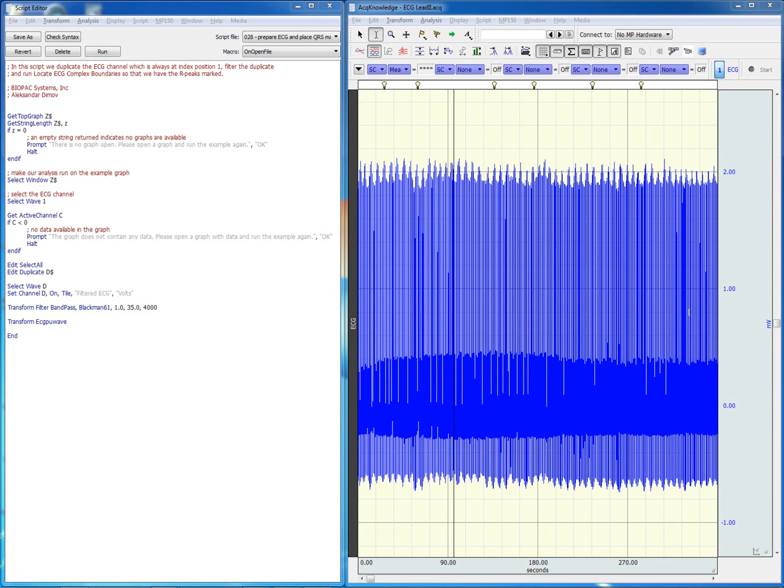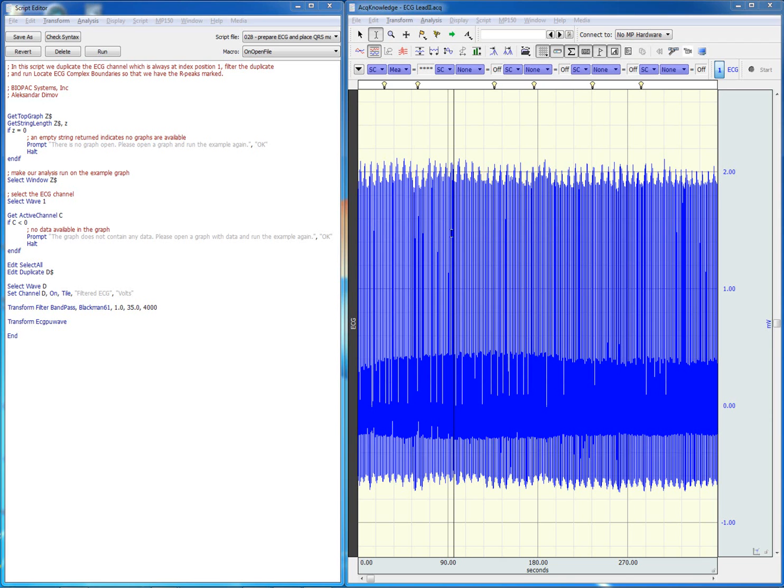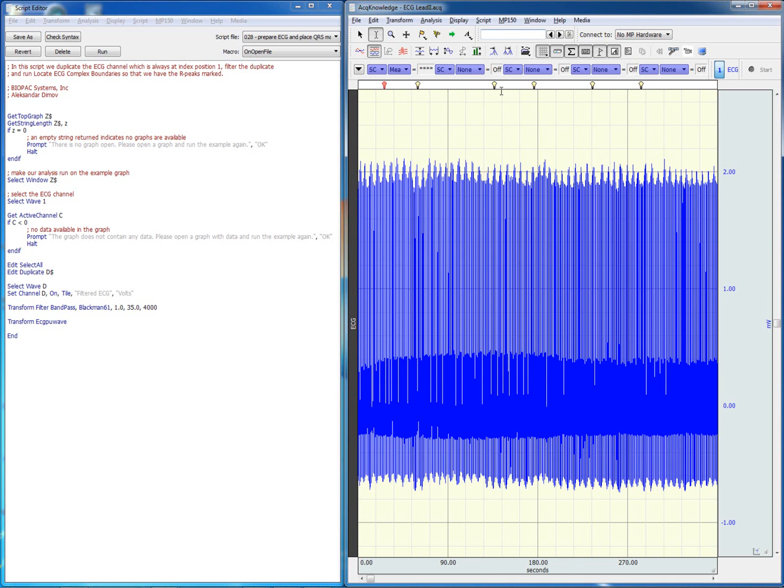In this video we'll illustrate several scripts that will help us analyze ECG data. In the current data file we have an electrocardiogram recording and we also have a number of stimulus events as indicated by the markers that appear here on top of the waveform.